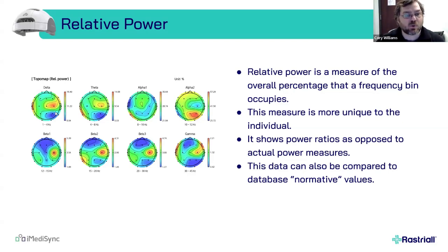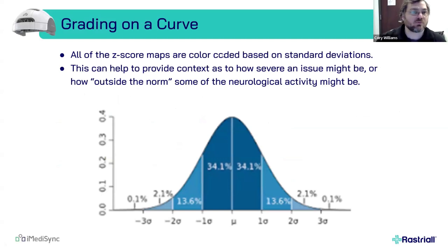And what we'll see here is this person has some slowing in the delta and theta range, and a little bit in the beta range at C4 as well. Their alpha production looks lower, right? And that's for this individual. Now we take that data and we can run it through a normative database, which will give us z-scores on how outside of the norm a given activity bandwidth is.